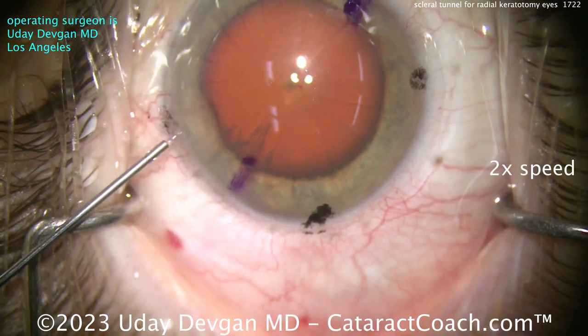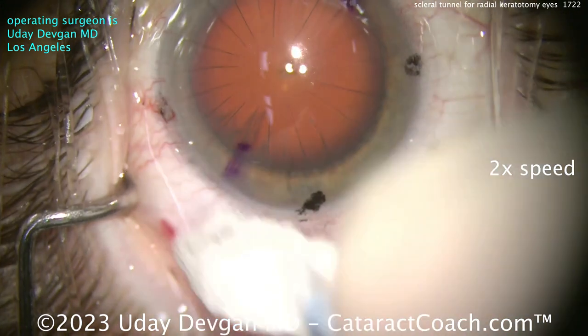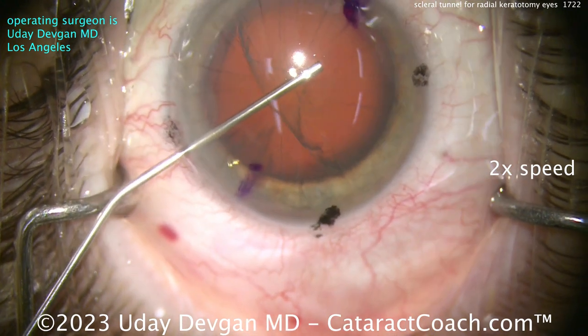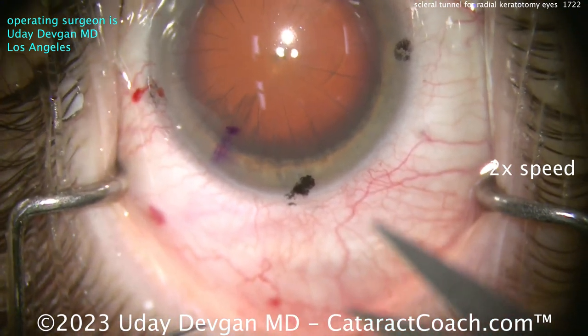Notice how I make that paracentesis between two RK cuts. Because it's small — less than a millimeter or about a millimeter wide — you can fit it between those two RK cuts without intersecting them. I put some lidocaine inside the eye, then some viscoelastic to get the AC nice and deep and protect the intraocular structures like the corneal endothelium.